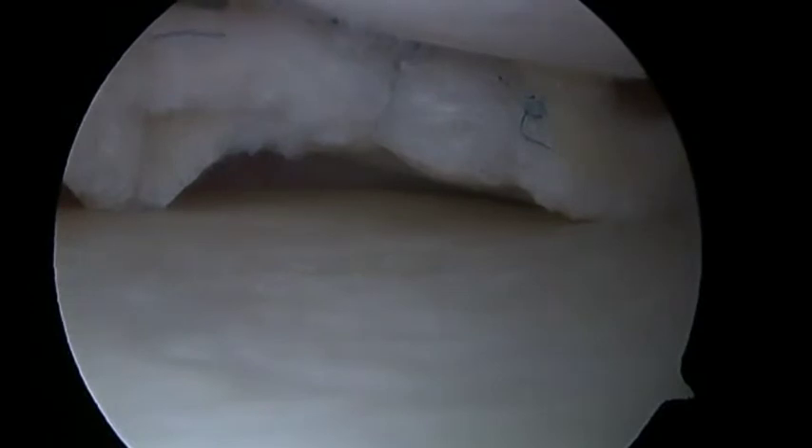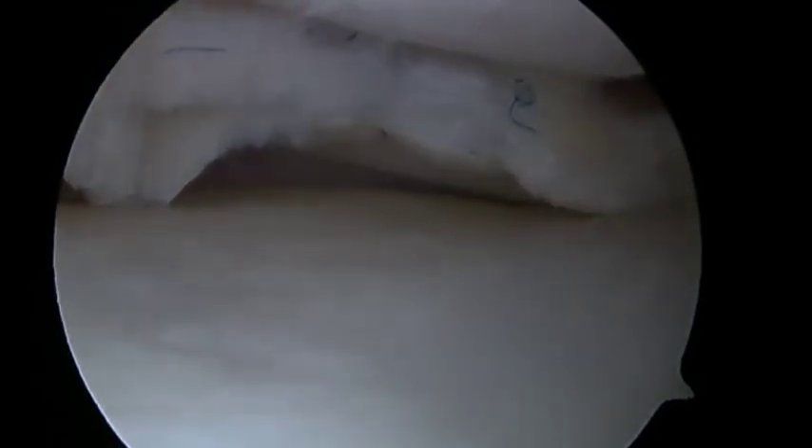After each suture is passed, an arthroscopic sliding knot is advanced over the superior aspect of the meniscus. This is then secured in place with three half hitches, with the knot lying at the meniscal capsular junction. This clearly demonstrates that the superior and inferior leaflets are being uniformly compressed. After the knot has been secured, the free ends of the suture are removed with an arthroscopic suture cutter.